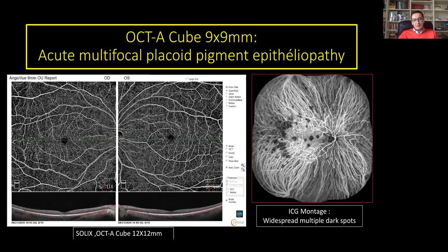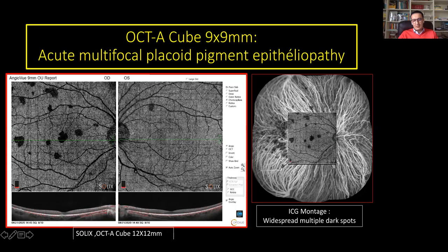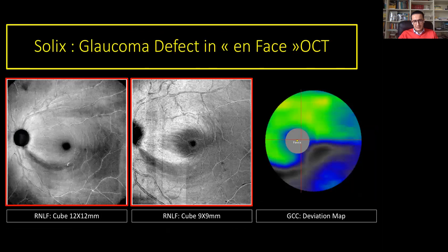Also in cases with inflammatory processes, as in this case of acute multifocal placoid pigment epitheliopathy, you can show very well the widespread multiple dark spots in a wide scan of 9x9 with a very good correlation with ICG montage. You can follow up this lesion one month later without treatment and observe the resolution of these dark spots.